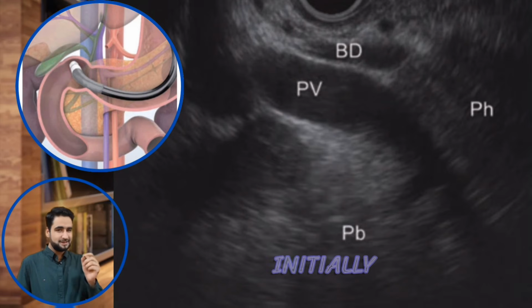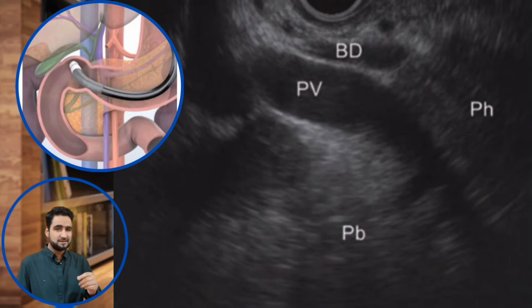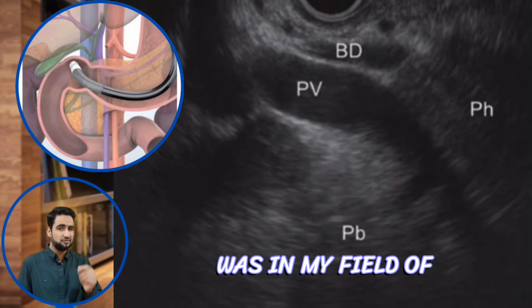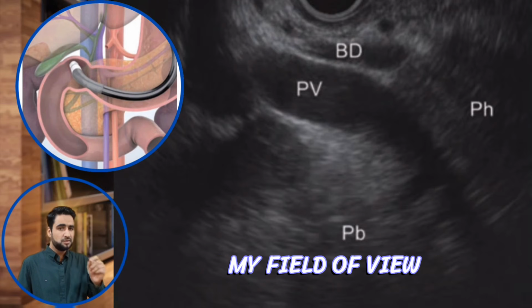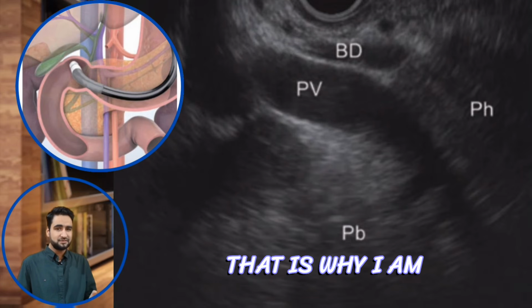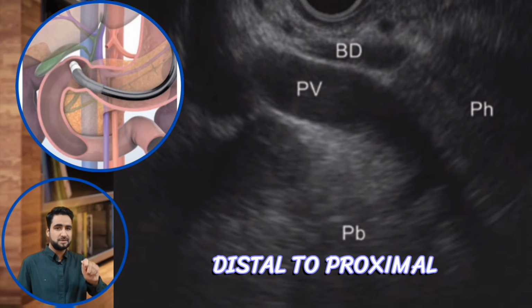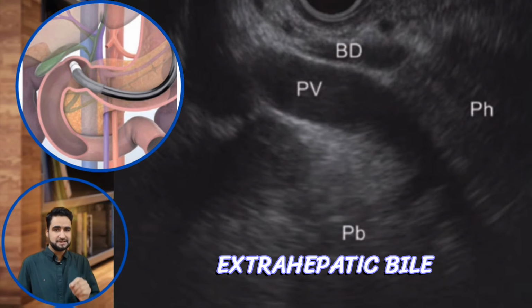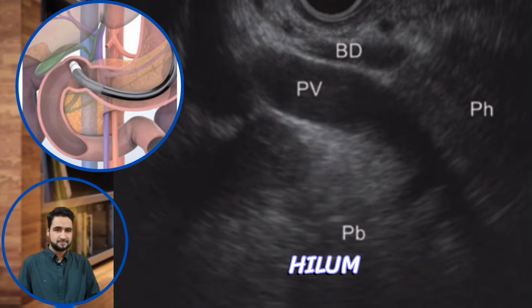Let me repeat it. Initially, the probe was facing posteriorly downwards. The distal part of the bile duct and pancreatic head was in my field of view. Now on anticlockwise rotation, my field of view moves from posterior downwards to posterior upwards. That is why I am actually tracing the bile duct from distal to proximal part. This is the best view to visualize the extrahepatic bile duct from the major papillary area to the hepatic hilum.